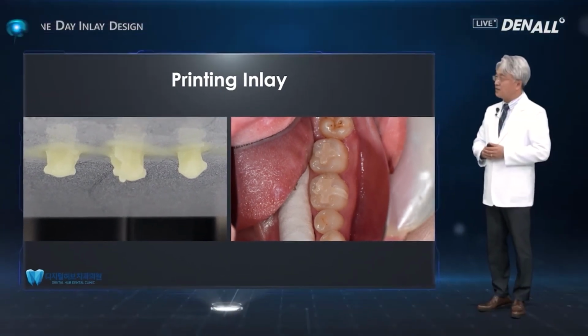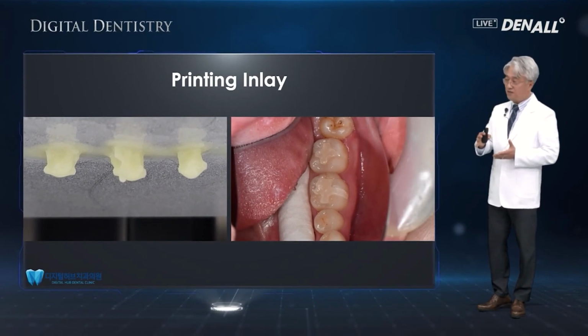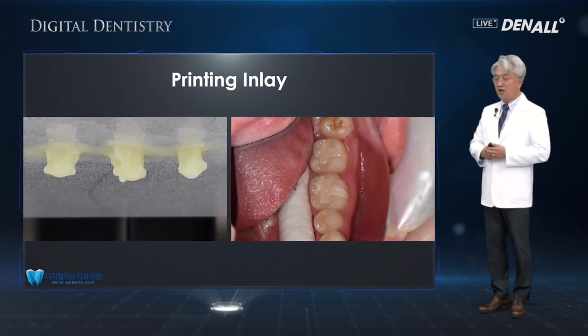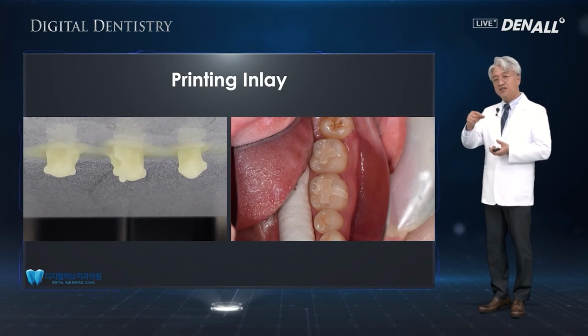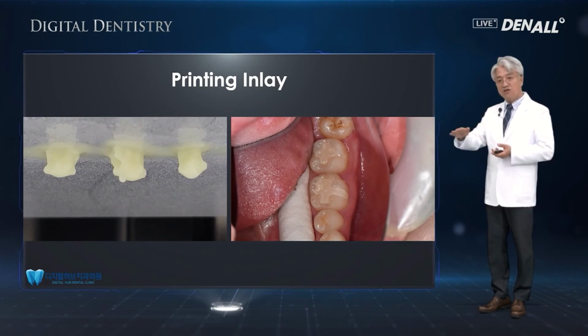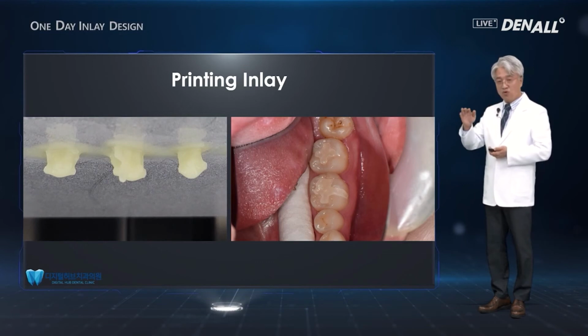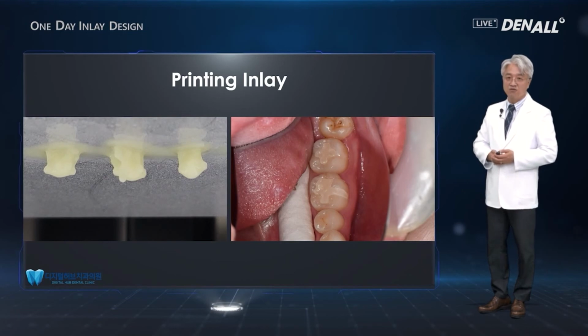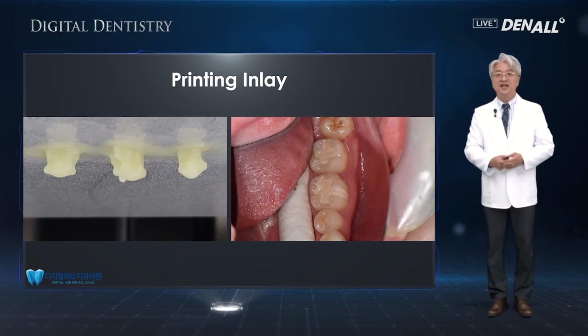Now, the fit and others are all being improved, and rather than adapting with the support to the patient, the support and other things are all removed before being delivered or adapted to the patient. So I think with such advancement, we can have much more satisfactory results.